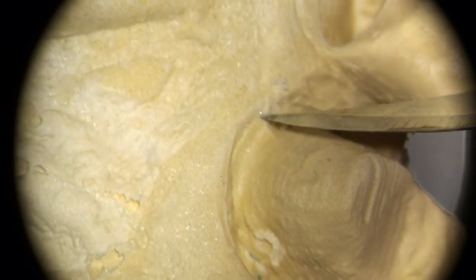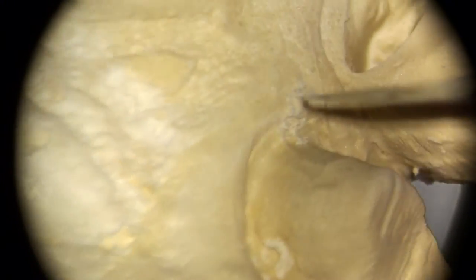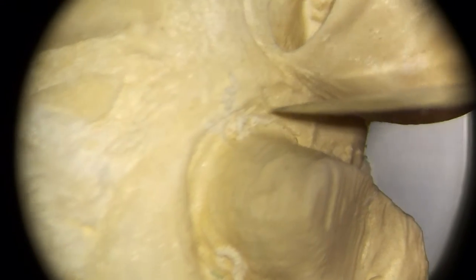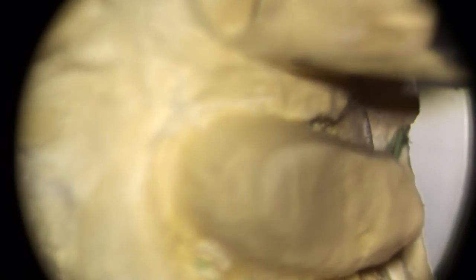Sometimes if the fingers slip just a little bit, instead of refining that margin up, boop, they can pop in there and just lower that. But since this is a little higher here and a little higher there, it's probably again just a tiny little drag. It usually comes from just not rinsing and drying that tooth sufficiently. Or maybe they didn't get their impression material in there quickly enough after they rinsed and dried it.